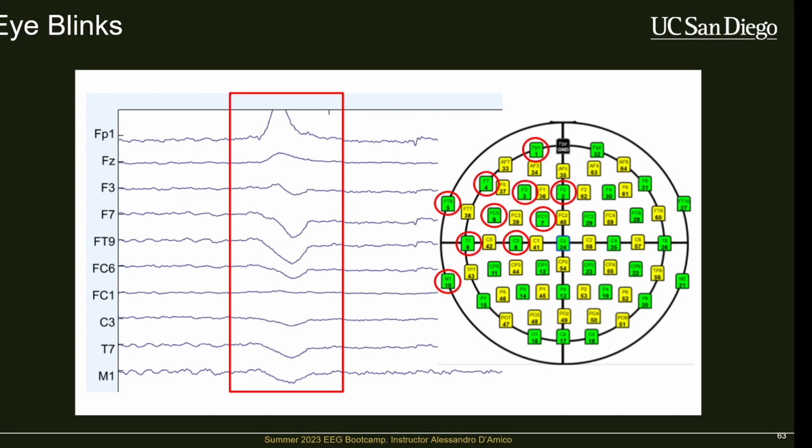The reason why this is so important is because often when we're doing ERP research, we are looking at systematic differences in EEG activity. So, for example, let's say I'm trying to study fear and I'm looking for some fear potential. I'm going to show pictures of like teddy bears, and then I'm going to show pictures of like mutilated corpses. All right.